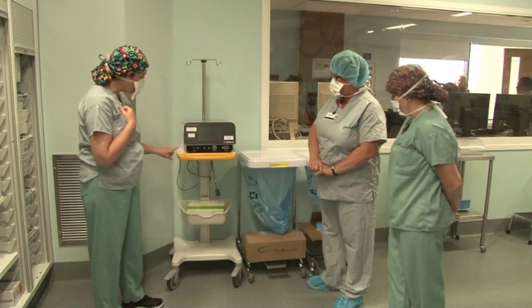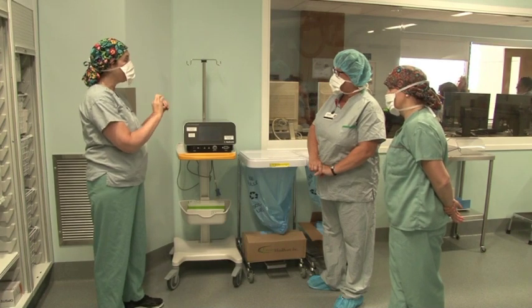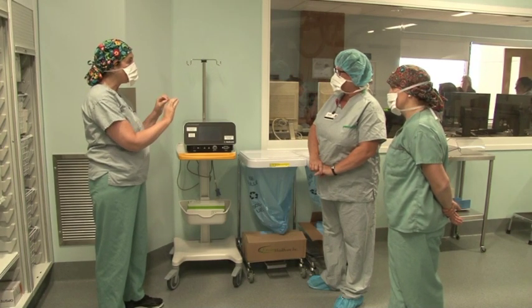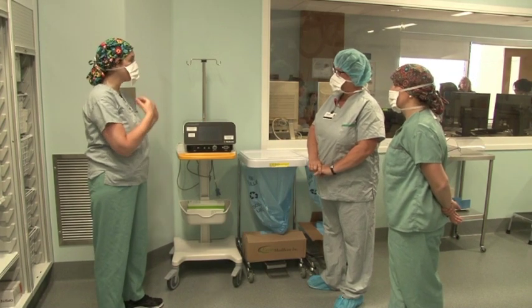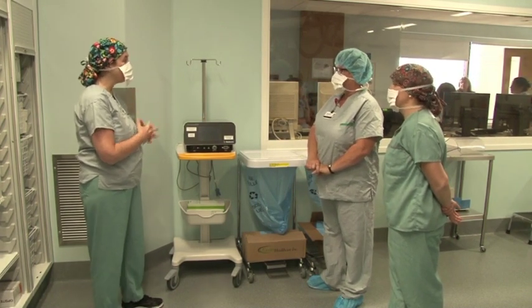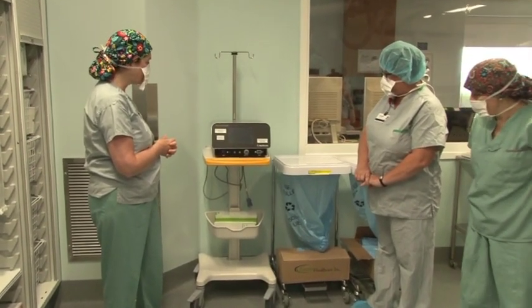So these new plasma cautery blades cut and cauterize, but they will not go through the lead that connects to the generator. So it makes the whole procedure safer, with less risk of damaging the leads. This is something we can start using in January with great success.